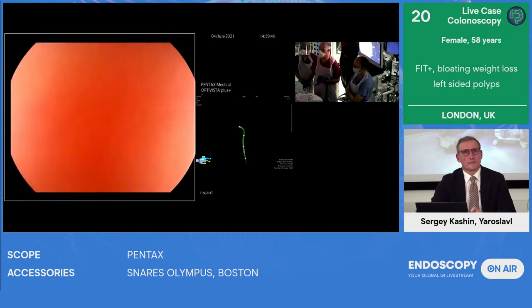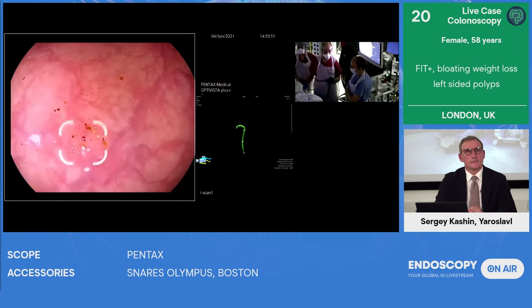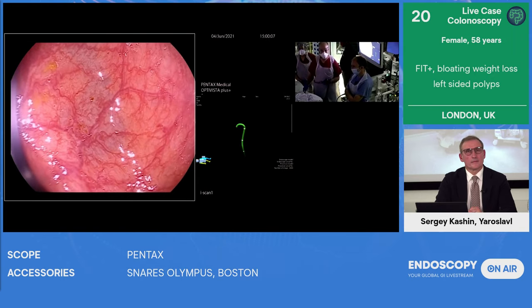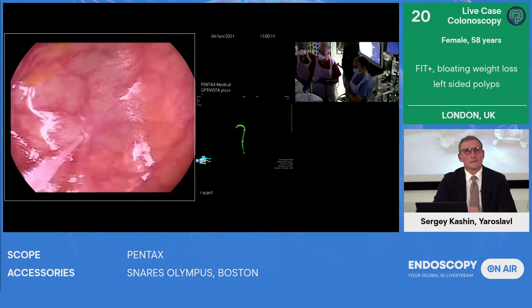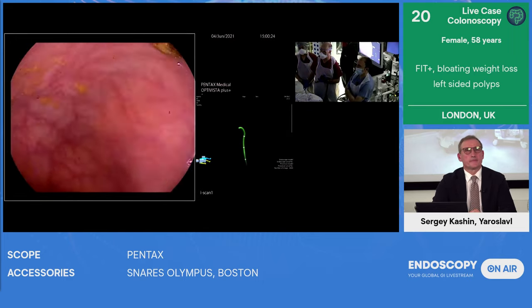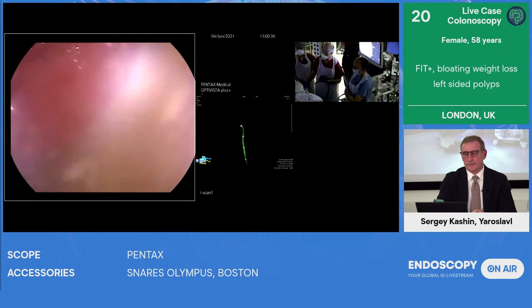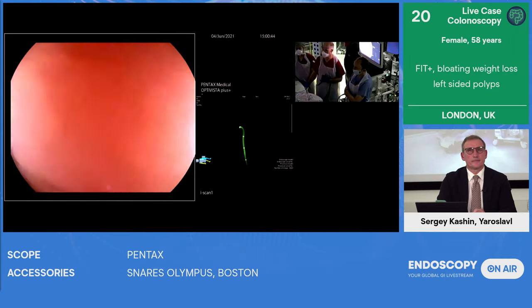And I noticed when you did the rounds earlier on, talking about what one thing would you get across, what's the biggest advance? To me, and I'm sure Ed would agree with this, when you see a significant lesion, your first time is the best time to remove it definitively. We can remove virtually anything if it's de novo and it's not previously had diathermy injury to it. So really, we need to spend more time looking and assessing lesions and then planning a proper resection, a bit like you would with a cancer resection. These big polyps are potential cancers and they need to be treated as such. We need to plan that properly and tee up a single definitive resection where patients are not needing to come back repeatedly for multiple procedures, which is costly, is not good for the planet, certainly not good for the patient, and may end up in surgery anyway. Well, that's my little preach.